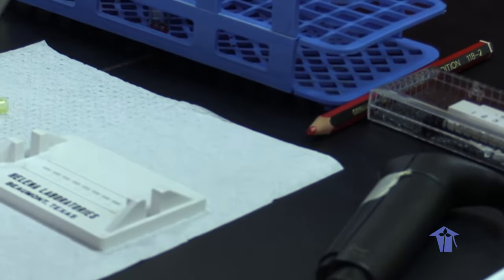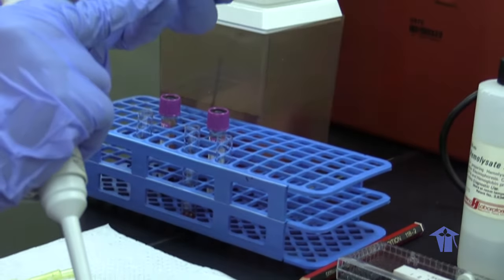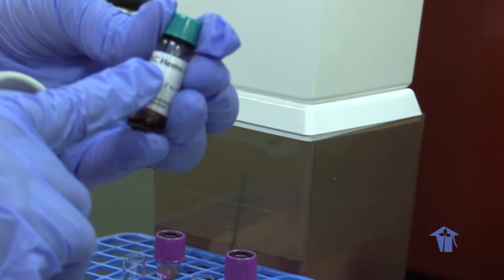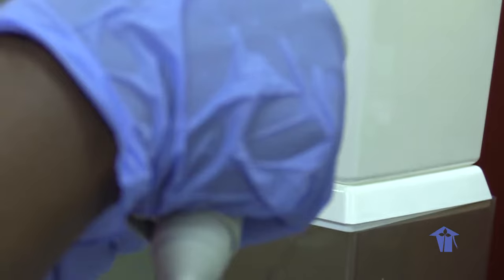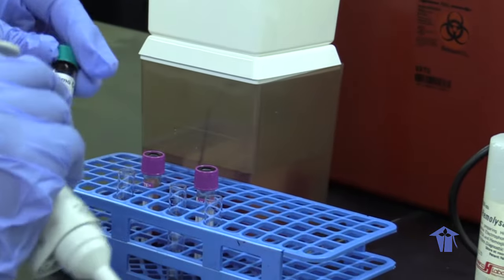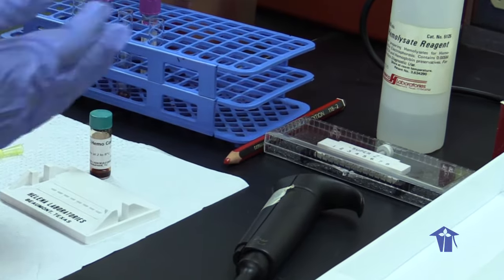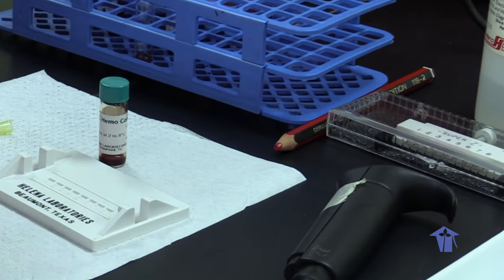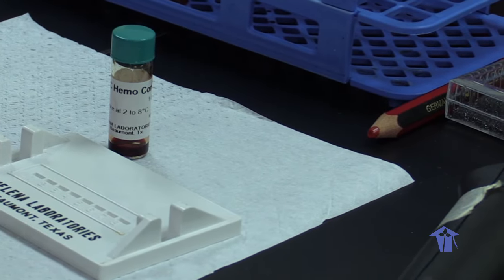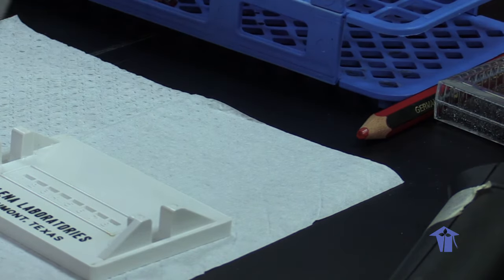So this here is a hemoglobin electrophoresis control sample. We have the A band, F band, S band, and the C band. In all laboratory testing, we need controls. In this case, we always put our control in well 1, position 1. Therefore, when we are reading our plates, we can read against our controls, and we'll have reference lines, reference marks where the different hemoglobins will migrate to on the cellulose acetate plate.